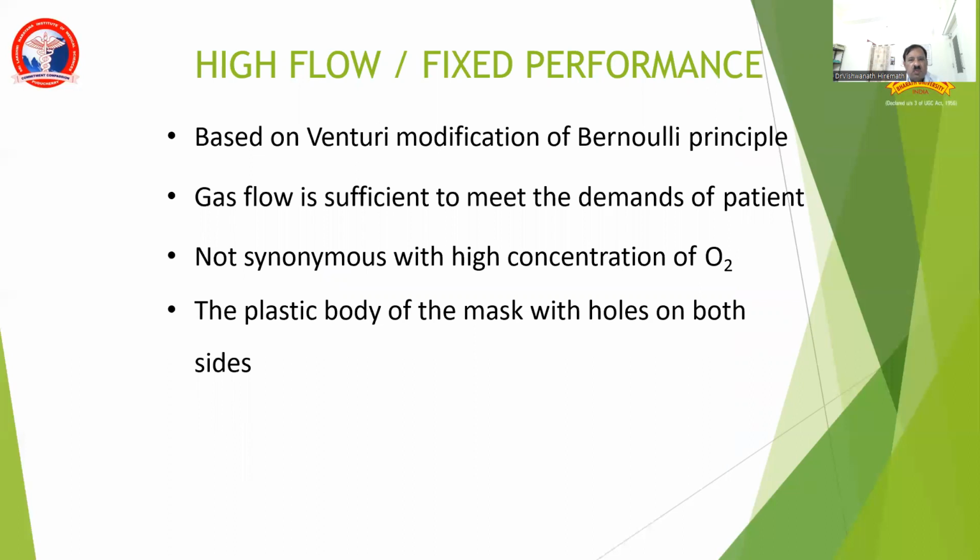High flow masks are fixed performance devices based upon the Venturi principle, a modification of the Bernoulli principle. Gas flow is adjusted to meet the demands of the patient.